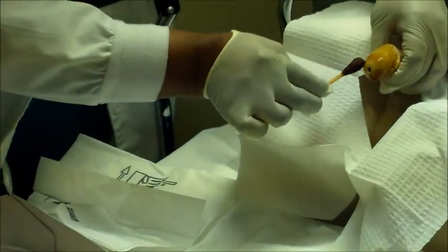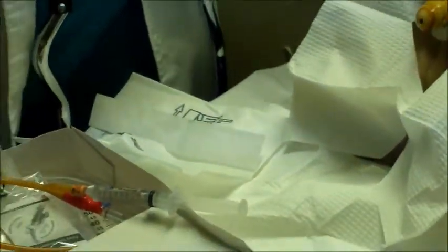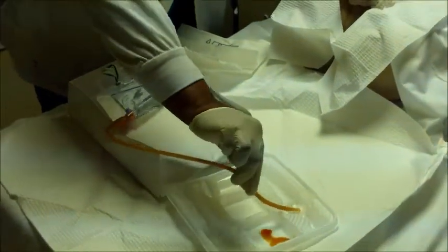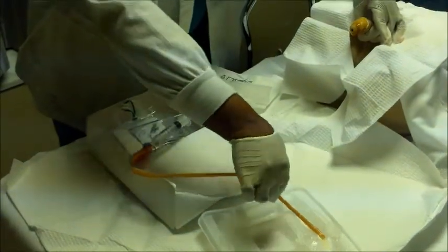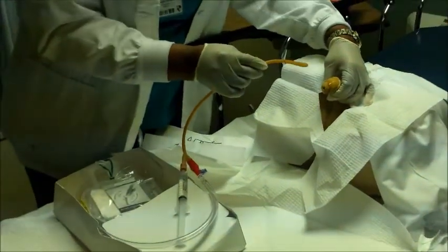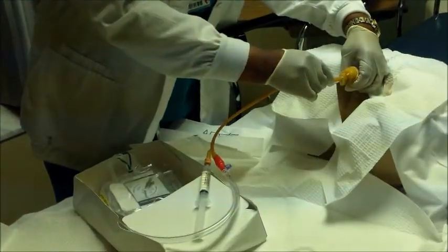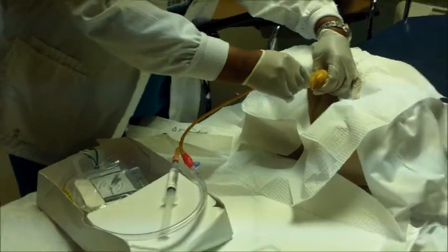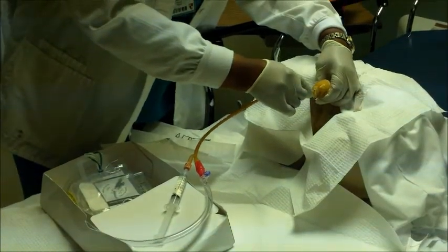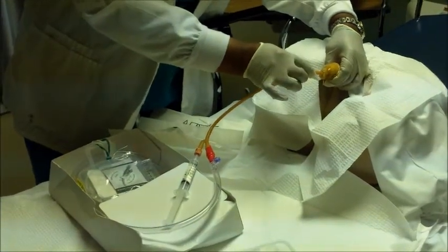Okay, the third one. Dispose of. Now, I want to take my Foley catheter and lubricate it with the lubricant. I want to go in, and like I said, I would tell my patient, just take a deep breath. Okay. And you want to keep on unless you meet some resistance. But now that I see some urine flow, I want to go an extra inch.